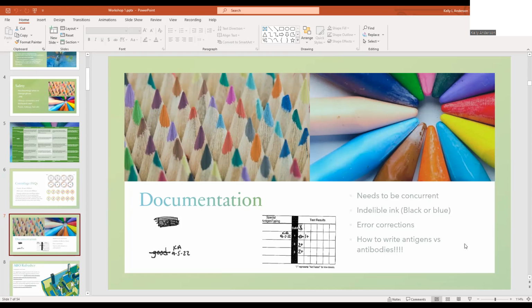It's extremely important to use the right terminology in blood banking, because these workups are often very long, longer than 8 hours. So you might start a workup and not finish it. If you pass something on to the next coworker and you say this patient has a Duffy A, and you really mean an anti-Duffy A, it could make them do extra work that's not needed. It could make them issue the wrong unit. So terminology is extremely important.